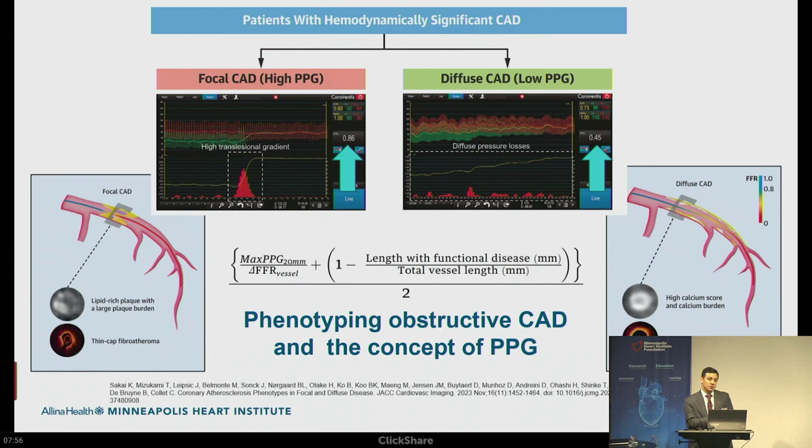Yader, phenomenal talk, and thank you for educating us. In practical terms, when you see a patient back in clinic that has been stented elsewhere, the two things that come to mind are, how is the stent doing, but also did I cover enough of the lesion? Where is this microvascular disease? Practically, where do you start? Of course, you might want to start with medical therapy, but once it is refractory, where should we start thinking, and when do you take this patient to the cath lab? You mean the symptomatic patient post-PCI? Post-PCI. Yeah, the symptomatic patient post-PCI.